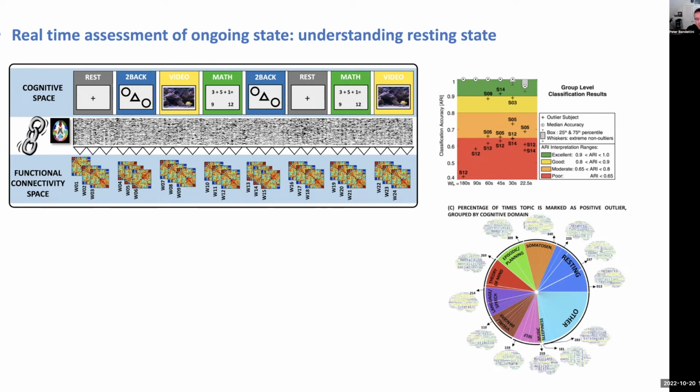And then what we did was, it's interesting, this is a big problem: when you look at a connectivity matrix and you find the areas that are salient or relevant to identifying that task, and you map that connectivity matrix back onto the brain, it doesn't actually look a lot like an activation map. There are connectivities that are somewhat overlapping, but outside the area of activation that you typically know for, for instance, a video or math task. So what we have to do then is deconvolve the data in those sections.